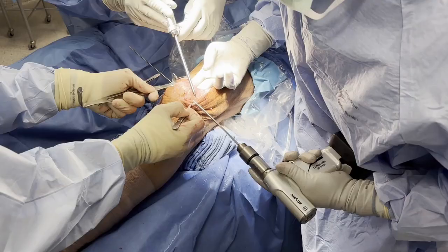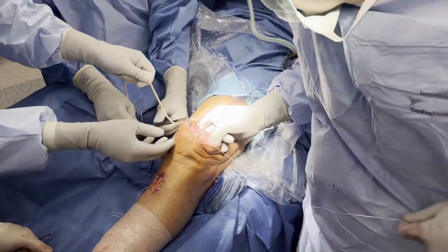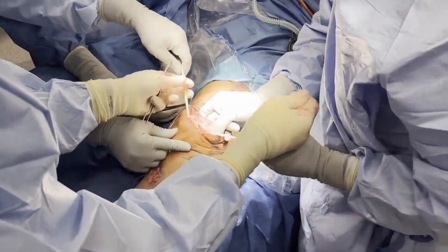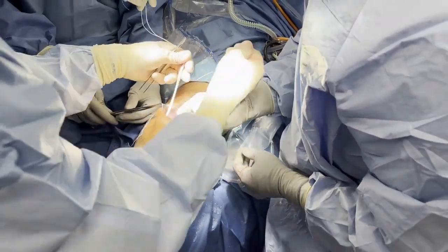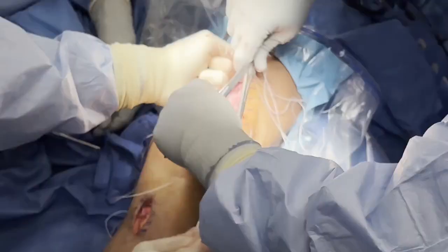The pin is then reamed with a 4.5mm endobutton reamer, and a Houston suture passer is used to place a passing stitch, which will then assist in passing the semitendinosus tendon autograft from medial to lateral. With symmetric lengths of autograft exiting each patellar aperture, the autograft is whip-stitched at the aperture to prevent translation.